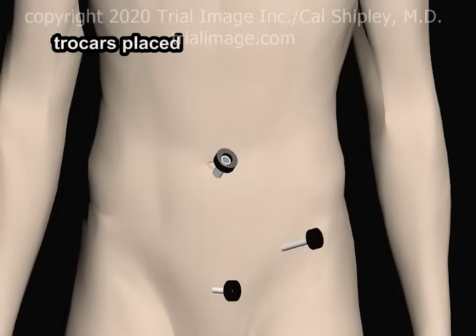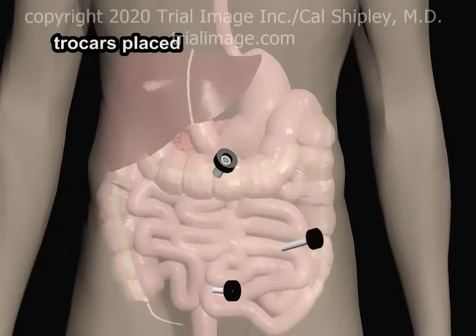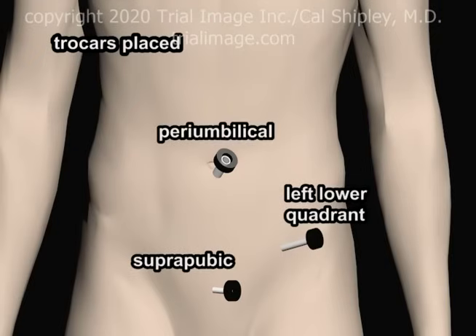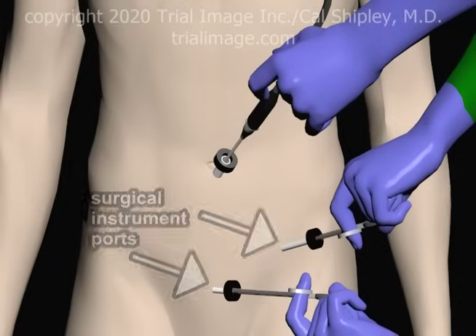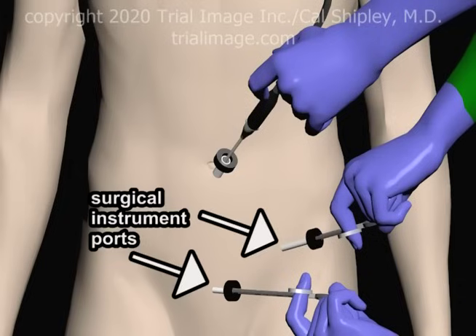Trocars, consisting of cylindrical metal tubes with collars, are inserted through the ports. Although there are several variations, the setup of ports and trocars depicted here is fairly typical, with placement in the peri-umbilical region, the left lower quadrant of the abdomen, and the suprapubic area. The left lower quadrant and suprapubic ports are used for surgical instruments.